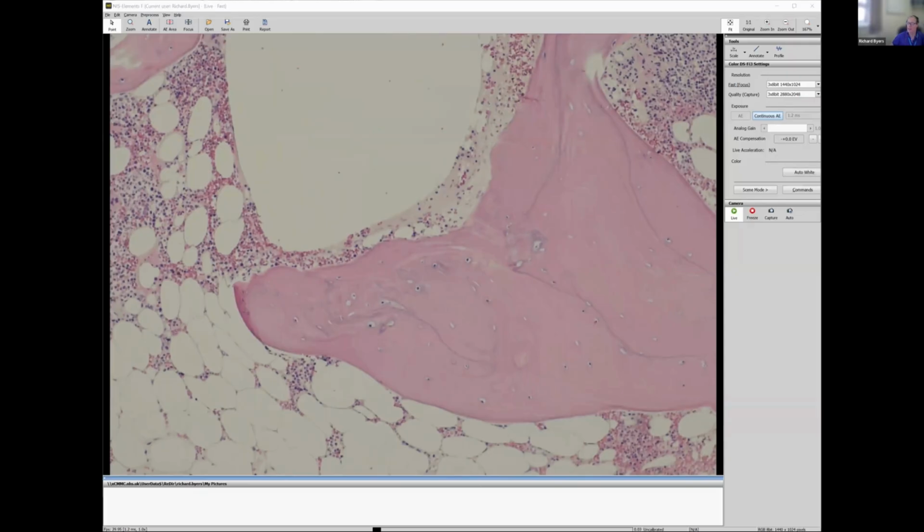And cement reversal lines are where the bone has stopped growing and then starts growing again. And you get this slightly denser area of kind of calcification just at that junction point. So we've got evidence of very focal woven bone in this area, evidence of new bone formation and successive waves of new bone formation with the bone stopping and then regrowing with these subsequent cement reversal lines.